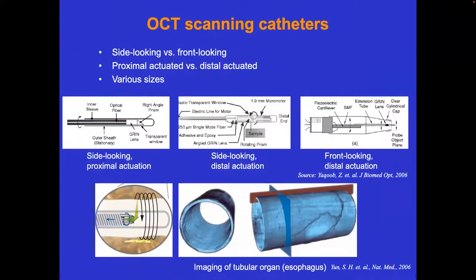Okay, also this one. And what can you do with it? So mainly endoscopy. And why this shift to swept lasers? I told you about the application of ophthalmology. There you use an illumination of 850 nanometers. That's because water is very transparent for that wavelength. You have to go through about 2.5 centimeters of water to reach the back of the eye. So 850 is excellent for that.